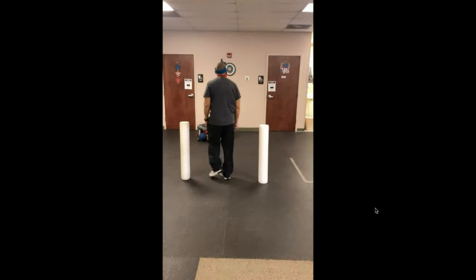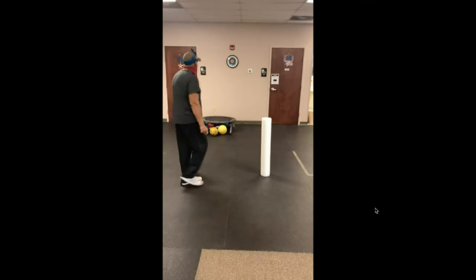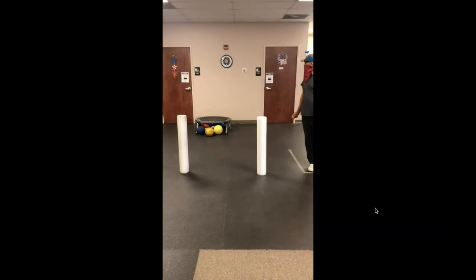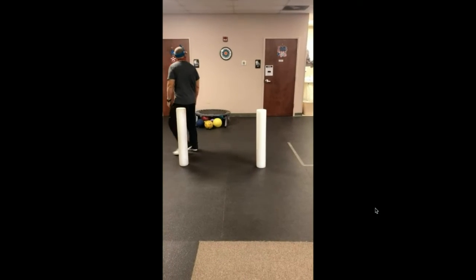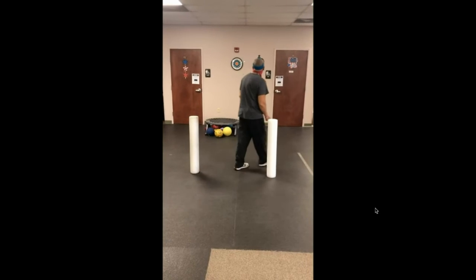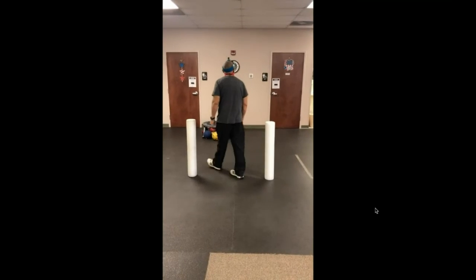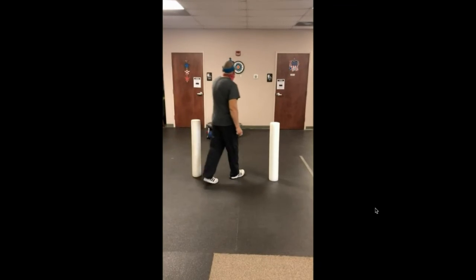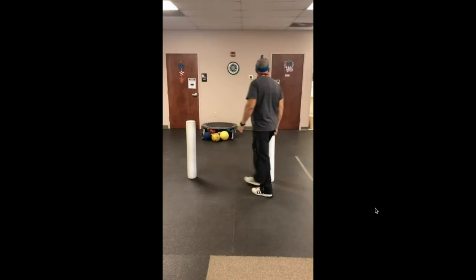So for him, this is probably not going to be that big of a deal functionally. For other higher level function people, like maybe some of your athletes, or people that have to move in tight spaces very quickly, this will be tough. The faster they have to move, of course, the chance of them having a dizziness score might go up. So on that VOMS of between 0 and 10, they might be higher on that type of score for dizziness. But they can train this.